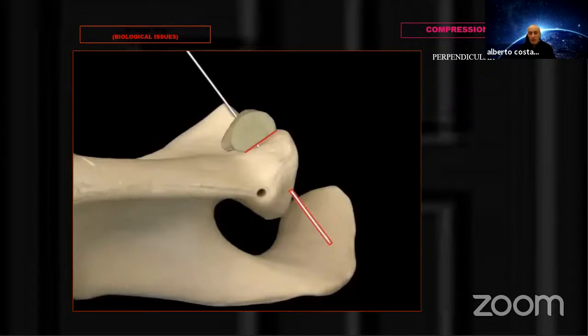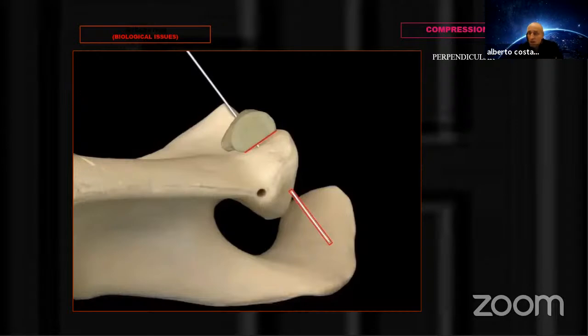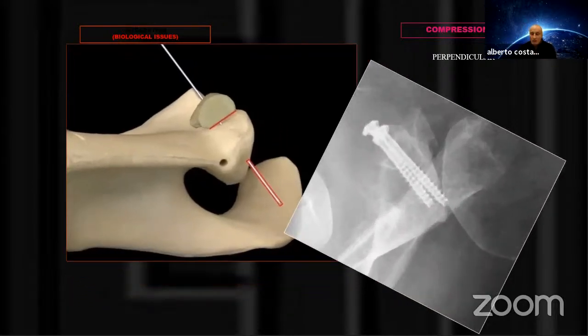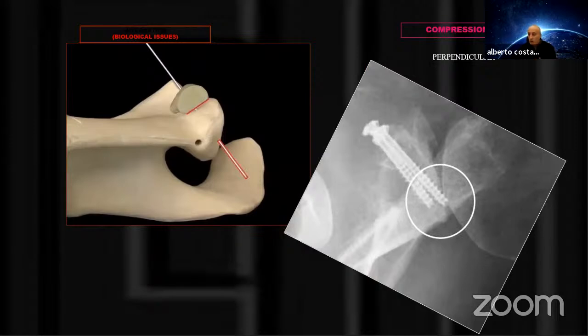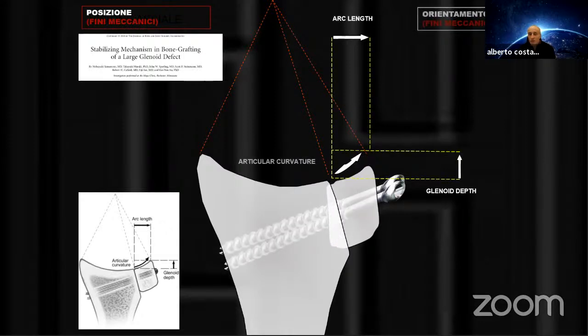So obviously, these things are easy when we have a big bony defect. But when we have a small bony defect, or we do the Latarjet procedure because of incompetence of the soft tissue ligaments, we may encounter this problem. Like in this case, this is a big problem. We need to revise this surgery, and maybe we have done more problem to the humeral head. So we have to carefully follow the curvature of the glenoid and the depth of the glenoid, not to be down, so protrusion, but never overhang the humeral head.